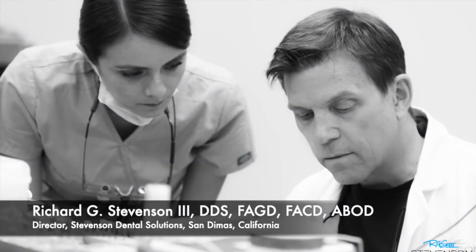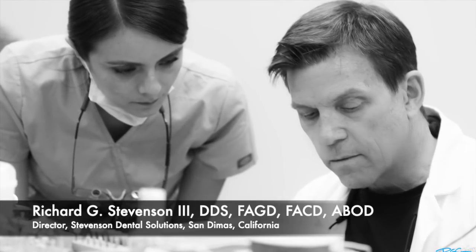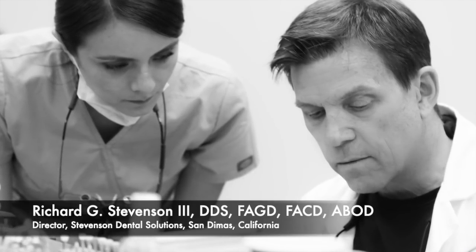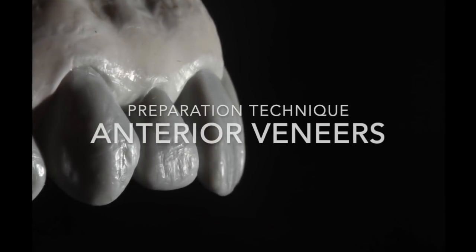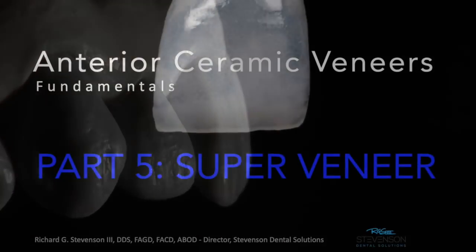Hi everybody, I'm Dr. Richard Stevenson and I'm the director of Stevenson Dental Solutions. Today we are going to discuss the fifth part of the veneer series, where we're going over the fundamentals of veneers on a type it on for the most part. In this particular section we're going to be discussing what I like to call the super veneer.